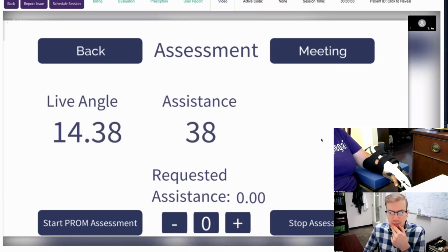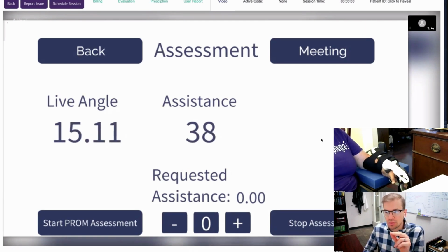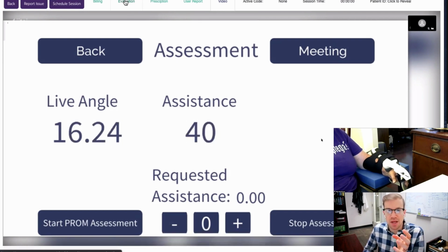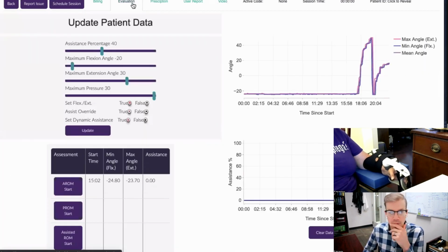There is a little bit of what's called reciprocal activation. When I'm asking you to go up, you might actually temporarily see those numbers go down. It's a bit of a simplification, but the circuits are a little bit crisscrossed. So when your brain is trying really, really hard to do the movements, it just sends a bulk activation to your muscles. And those that are most dominant, which happen to be your flexors in your upper extremity, just happen to kick on. And that's why we get that activation into flexion. Yeah. Very, very common.